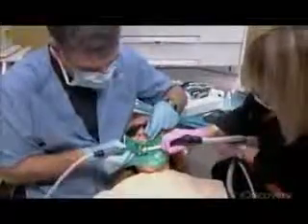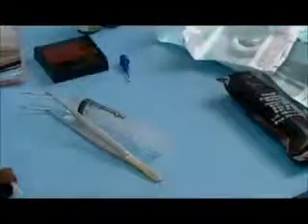He switches to a smaller bit to excavate the remaining filling particles and to remove decay. Each cavity must be completely clear before the restorative work can begin. The dental assistant then scrubs an antimicrobial solution into the tooth. Then she brushes an acidic conditioner into the cavity. The dentist activates the conditioner with a halogen light.